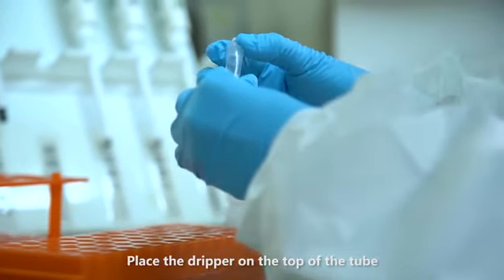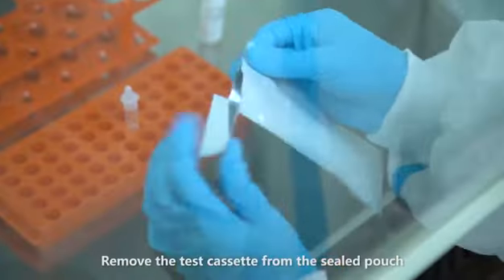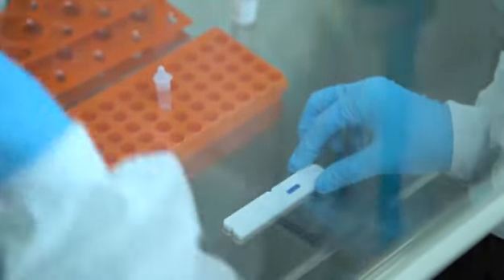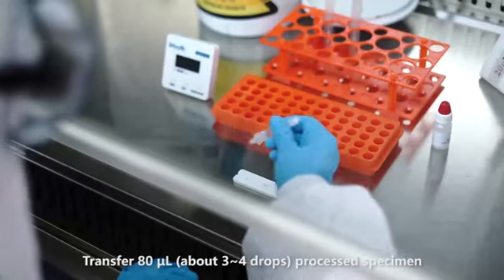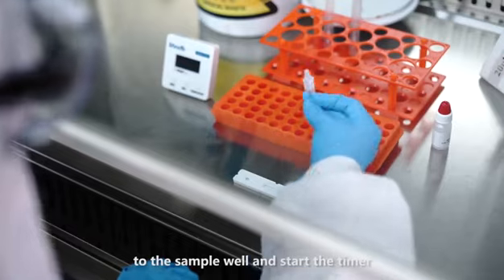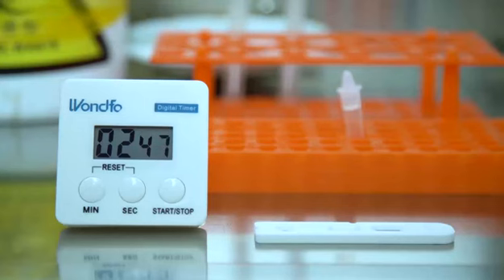Place the dripper on the top of the tube. Remove the test cassette from the sealed pouch and place it on a level surface. Transfer 80 microliters, about 3 to 4 drops, of processed specimen to the sample well and start the timer. Read the result at 15 to 20 minutes.